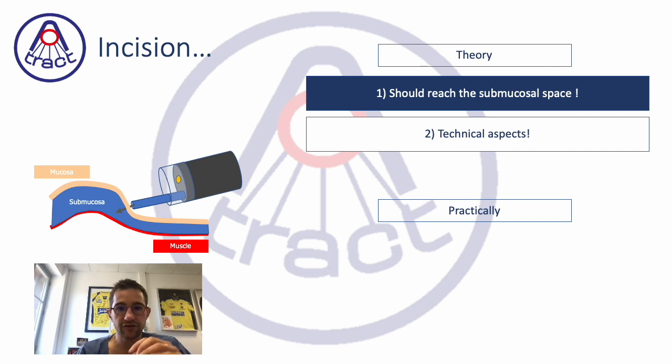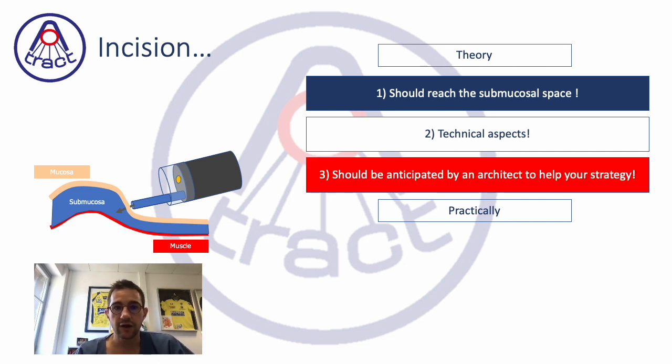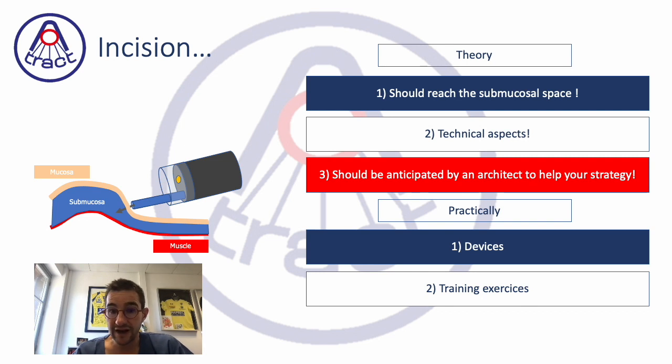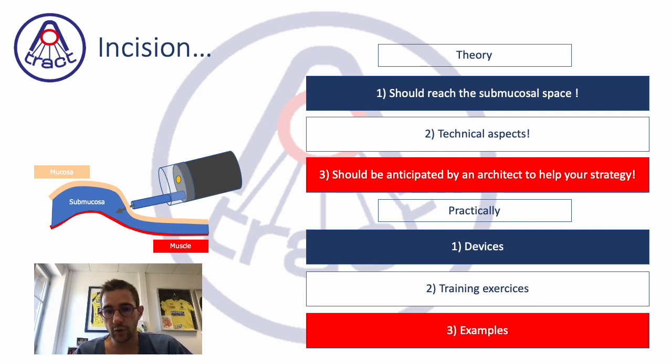Second point, we will discuss many technical aspects. And we will also discuss particular situations, because your incision will be done thinking about your strategy: how my incision will facilitate my strategy for this lesion. So for every lesion, you should have a strategy from the beginning, and you should do your incision in order to serve this strategy. We will discuss quickly the devices. Some training exercises will be given, and we will show some examples which are quite particular.